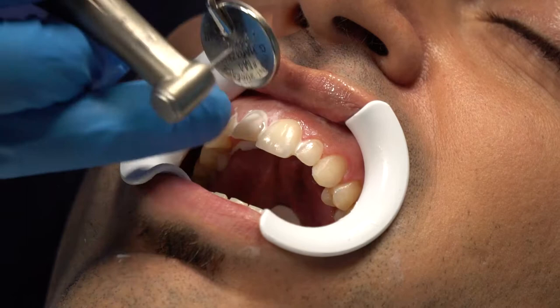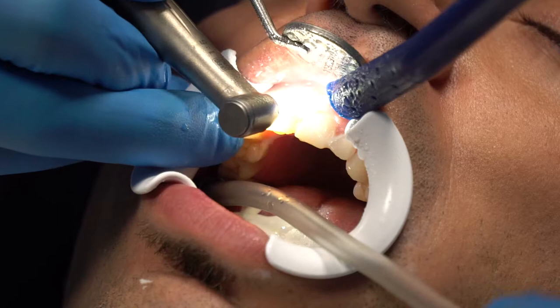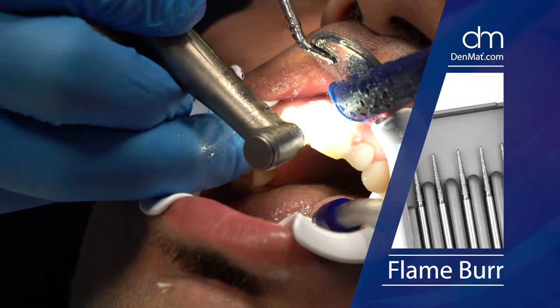My theory is let's try a little space — increase the dye spacer as you would. I'm going to go in and gently contour, probably starting at the mid-facial and go right down to the free gingival margin. I'm not going to prep a lot, but I do need an increase in dye spacer. What I'm using is a red — I call it a fat flame — what I used to use on gold work to put a bevel on.